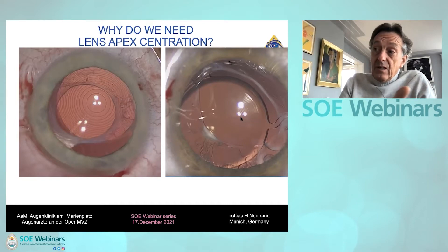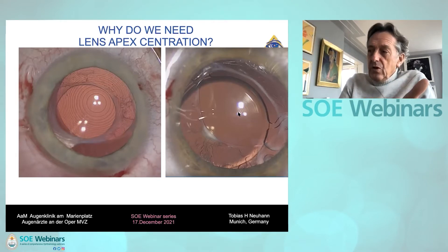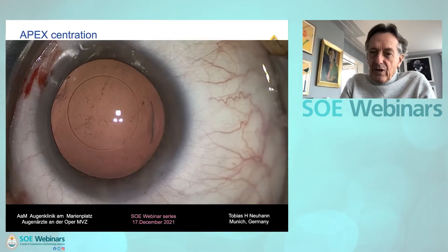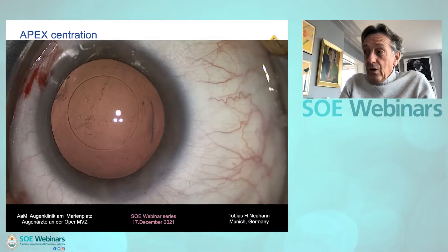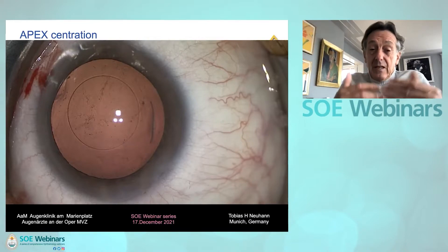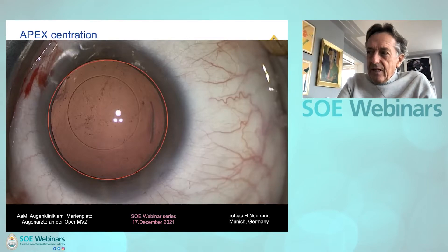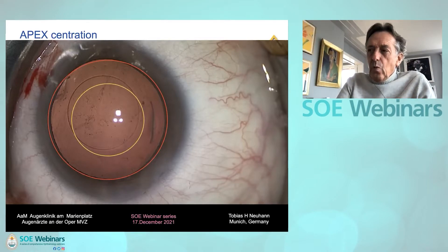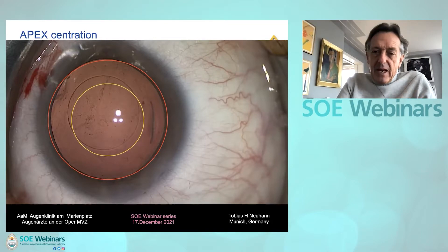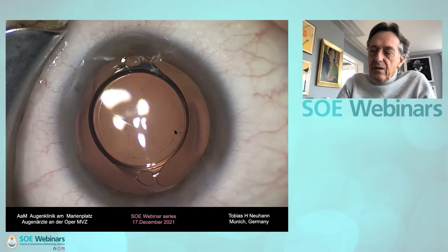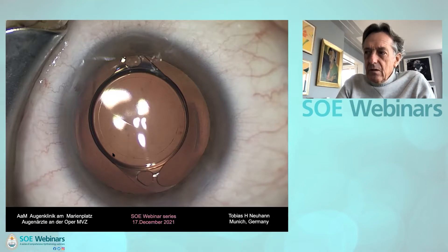In the other eye we see the decentered multifocal IOL where the patient looks through the peripheral diffractive zones. Here is an example of a post-femto-laser apex centration — is this a yes or no? Because this capsulotomy looks obviously completely decentered. The red circle shows the dilated pupillary margin, and the yellow circle shows where I would have centered the manual capsulorrhexis. Here we see the same case with the implanted EDOF IOL. The 100% congruent margin of the laser capsulotomy proves that the apex centration really works.